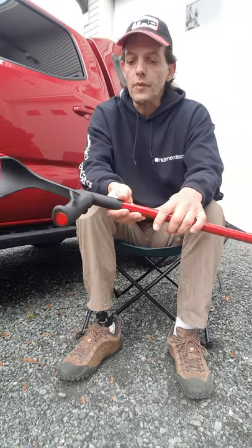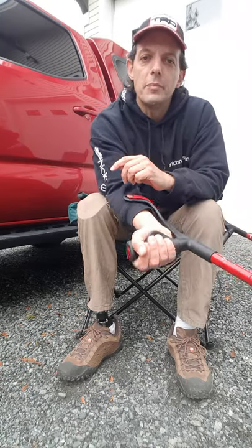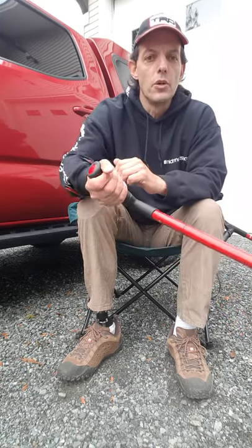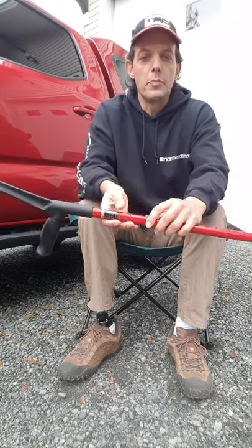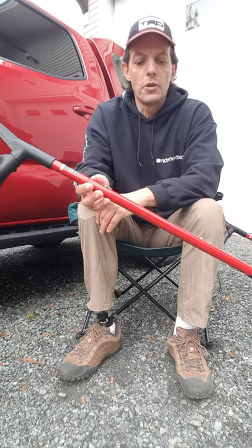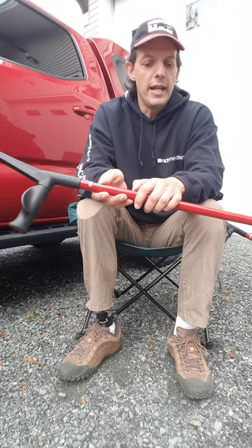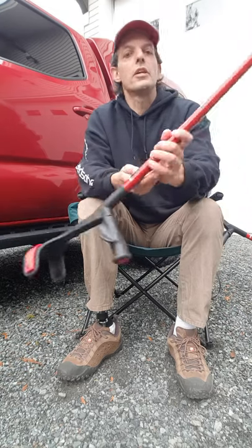They still have that really soft ergonomic handle, and that makes a big difference if you like to go on longer distances when using your crutches. I typically go without my leg on a Sunday, but I still like to get outdoors and do things, and these are my mode of getting around.